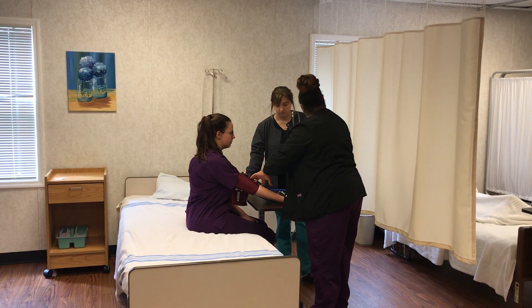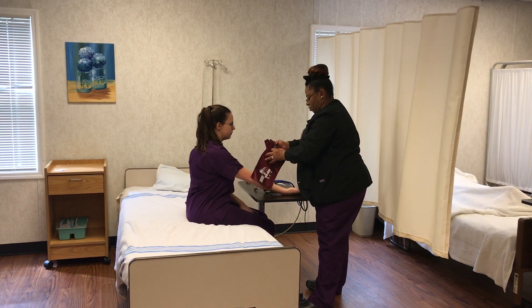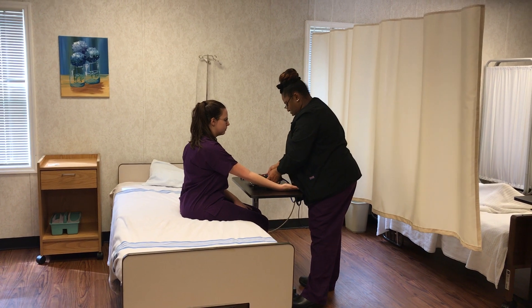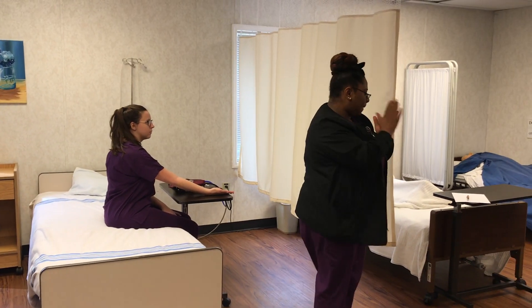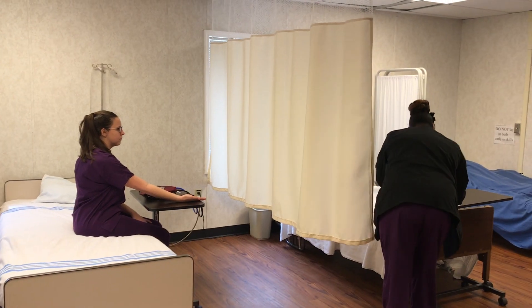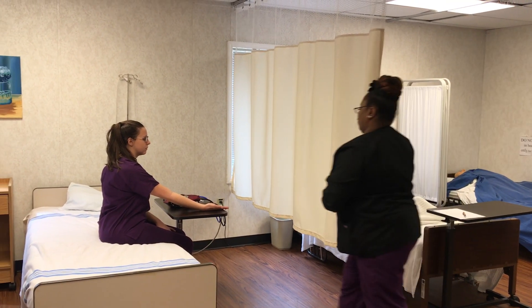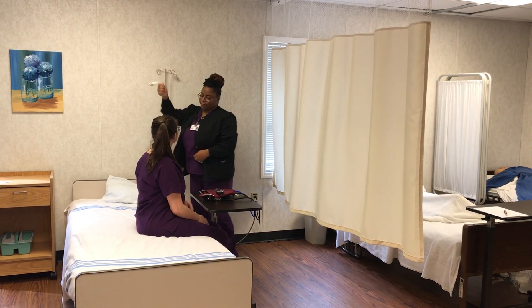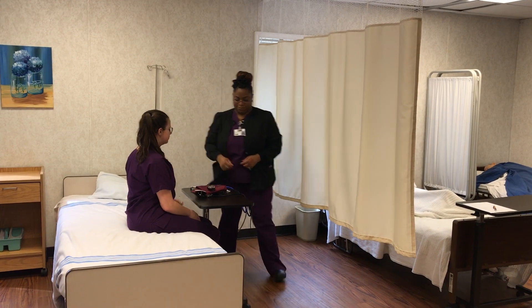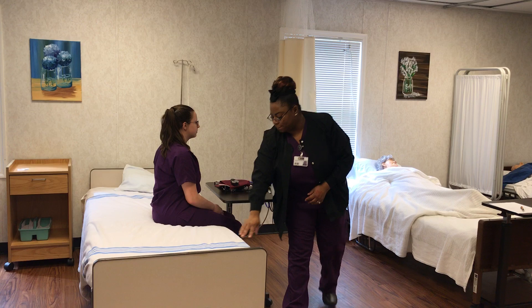You'll take the cuff off the patient. You'll record the measurement, washing your hands first. You'll give the client their call light, un-provide privacy, and check that the bed is locked and lowered.